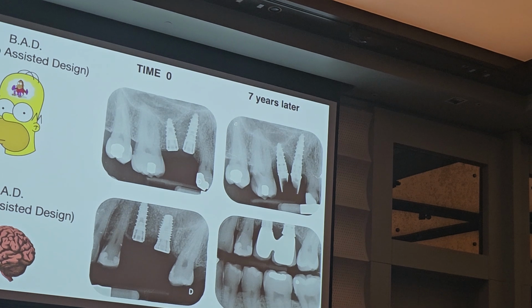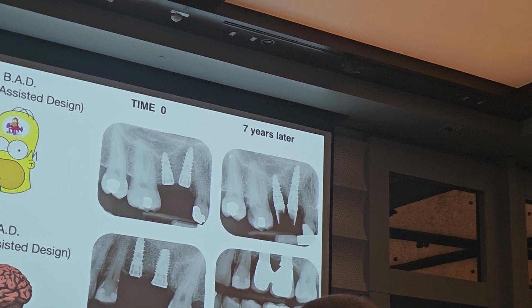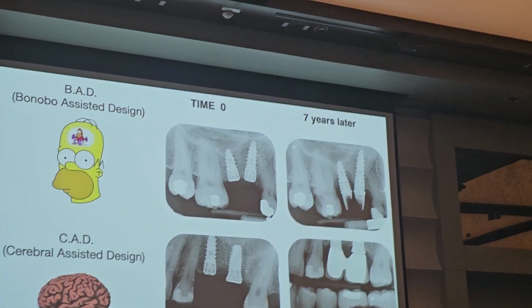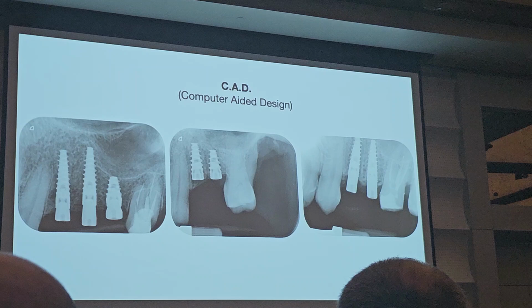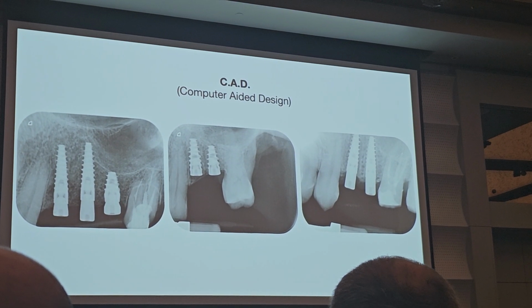You know, nowadays use guided surgery, at least for the pilot drill, because nowadays it's very easy. It costs 20 euro for doing a guided surgery. I mean, there is no reason to do that kind of job. Okay, that's stupid. I did it so many times that it's so stupid. Now it's very easy to place the implants in the right position without any headaches.